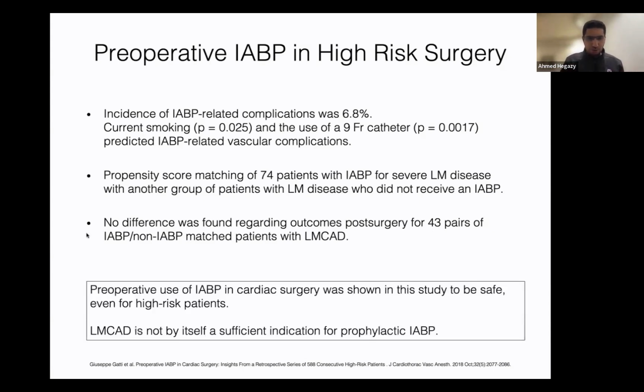So what they concluded was that left main disease is not itself a sufficient indication for prophylactic balloon pumps. And they said preoperatively, the use of balloon pumps in cardiac surgery was shown to be safe even for the high-risk patients. So this was a retrospective cohort study. It was not a randomized controlled trial.